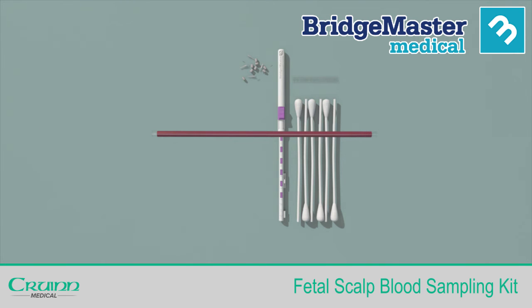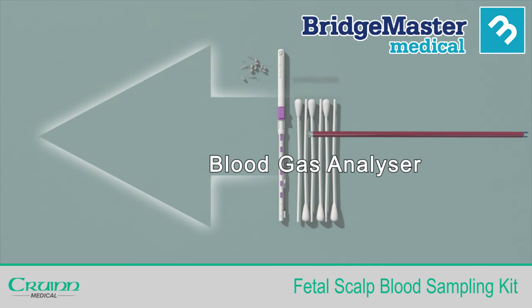After removing both end caps, insert the tube into your blood gas analyser. In the unlikely event that the capillary tube does not immediately fit, there is a universal adapter which should fit the majority of blood gas analyser machines. Simply fit to one end and then re-attempt to insert the tube.